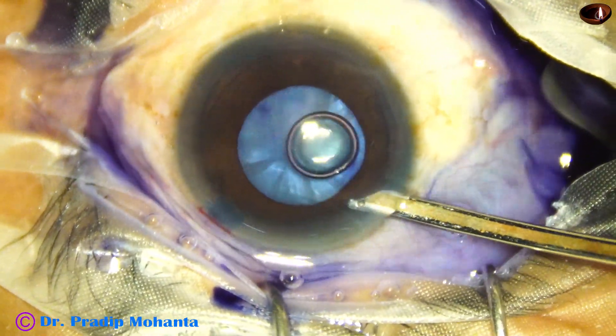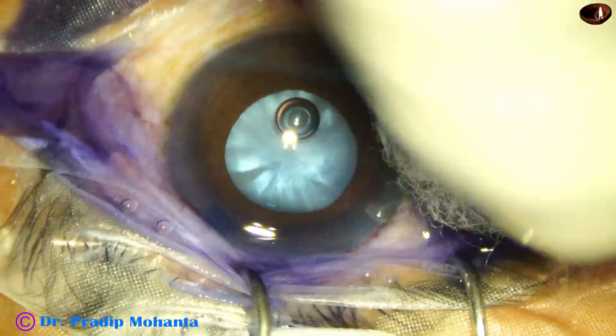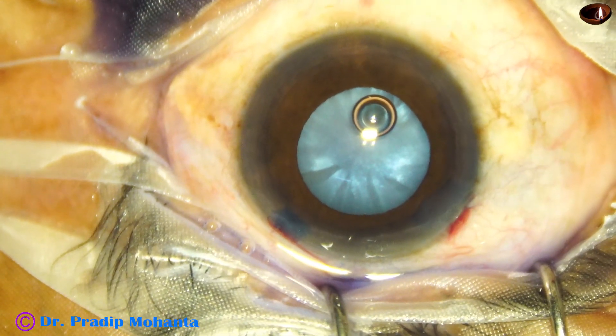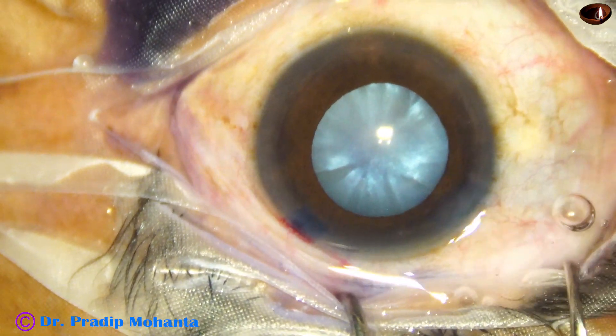Now the dye is washed out. We have used adrenaline, but the pupil has not dilated much. However, the size of the pupil is about 5 mm at this moment, and an adequate-sized rhexis can be done.